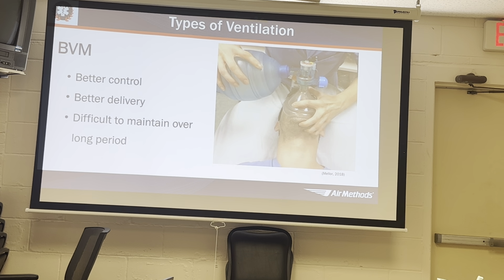Basically, I wonder if way back in the day, if you look at the history of respiratory therapists, they were just literally squeezing a bag. I thought that was their whole job or something. But this is a bridge, right? We don't bag people forever. I really like talking about bagging people. If you can't tell, I've probably brought this up 100 times already. I feel like in nursing, this is something that we do, and something that we do a really bad job at doing.